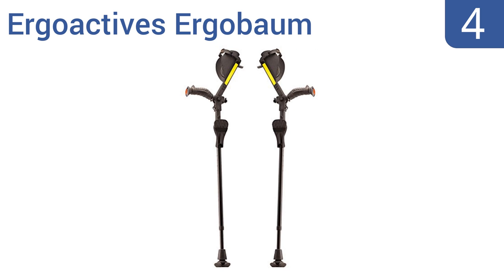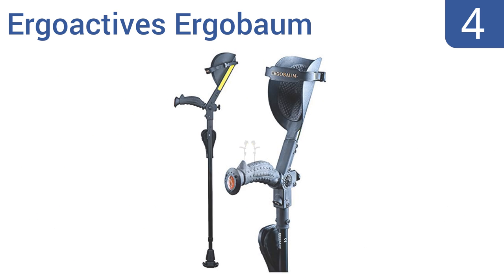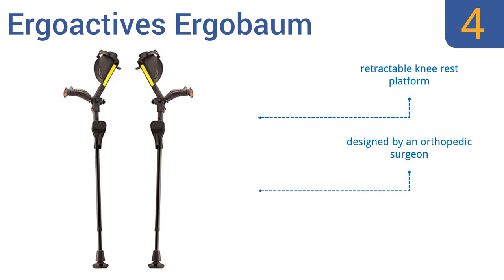At number 4. The ErgoActives Ergobaum are as nifty as they are multifunctional. In addition to their patented shock-absorbing technology, these crutches also have a built-in LED lamp, a horn, and safety reflectors. But they are very expensive. They also include a retractable knee rest platform and were designed by an orthopedic surgeon. However, the hand grips are not comfortable.